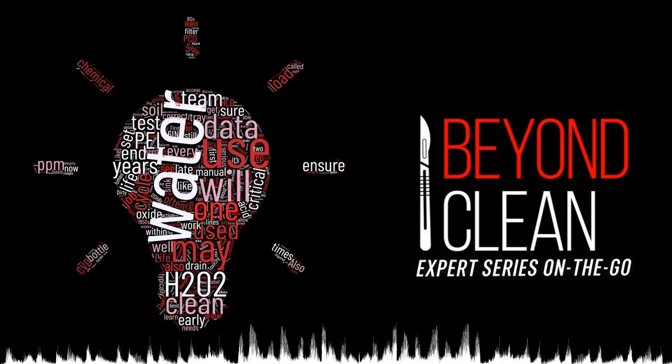Critical water has far lower contaminant levels, so it can dissolve residual mineral, detergent, and soil deposits that may remain on the instrument, finishing the job of making instruments clean, residue-free, and sterilizable.